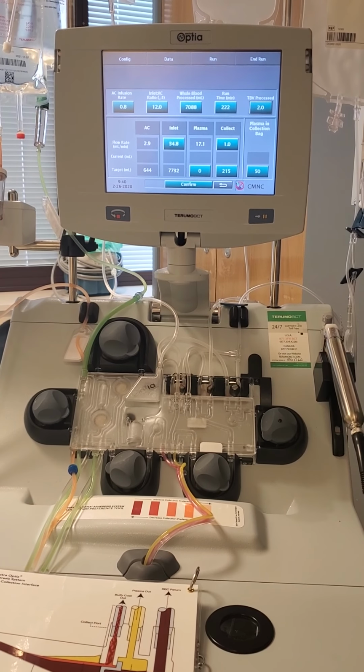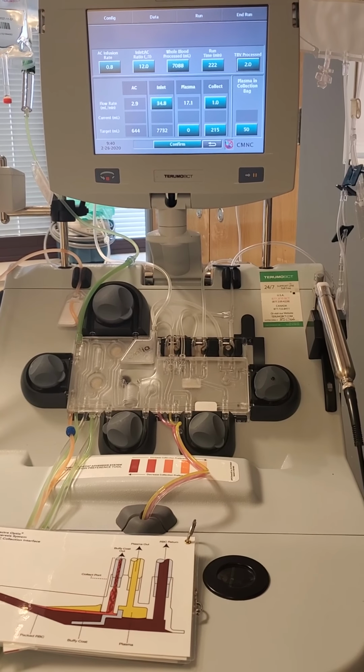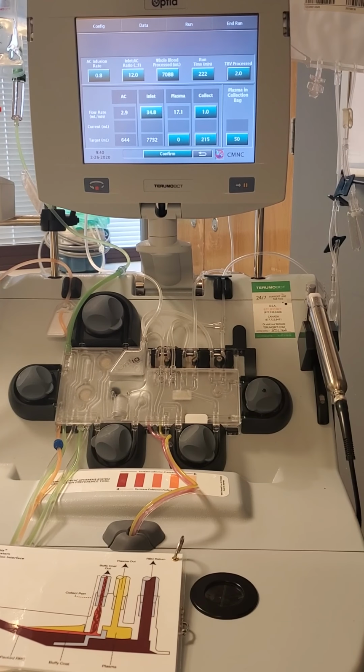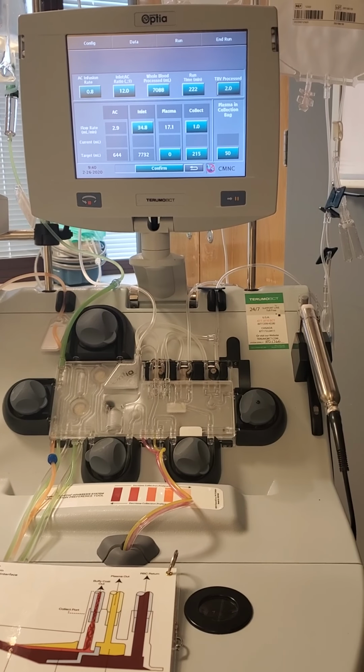It's done priming. We've completed the first portion of automated prime. We entered the patient data: gender, height, weight, hematocrit. Then, when I confirmed all of that data, up popped the run value screen. This is the one I affectionately call nasty numbers.